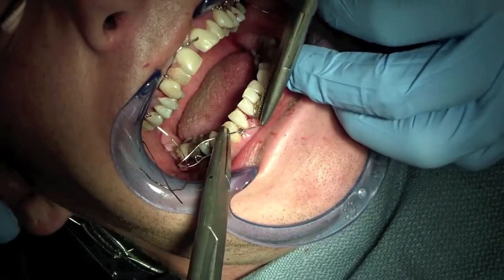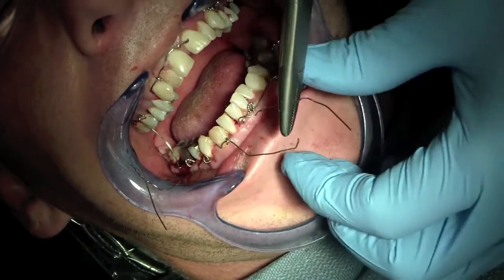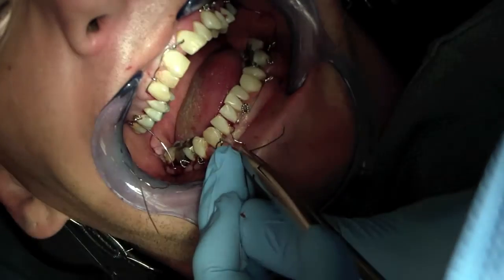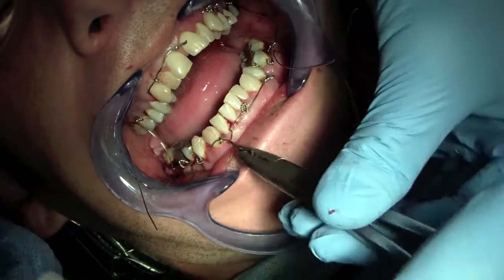In this video I don't show at the end making it into a rosette. The loose ends, once they're twisted together, you twist it like the rosette — the little things you see in the background. If you take a look at one of the other posts, I'll show you how to do this.